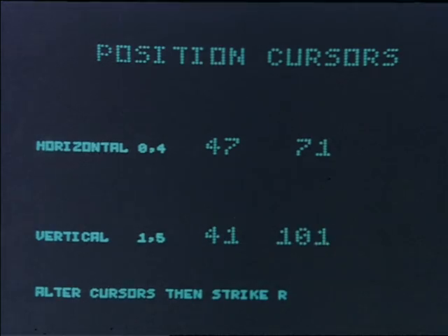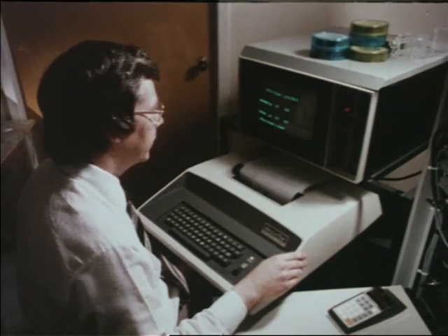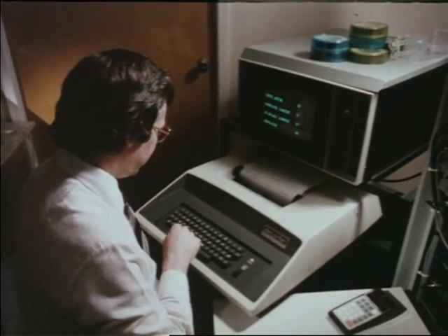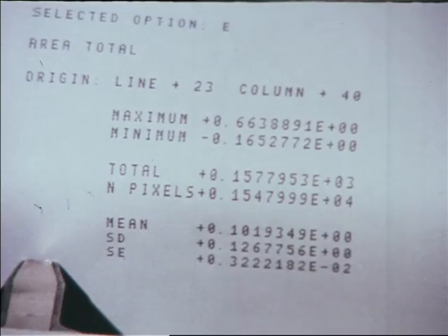The colors show how the density of the bone varies, and it's bone density that changes in many crippling diseases. The progress of such diseases can now be monitored. Any area of the image can be selected for investigation. Then the total weight of bone within the box is calculated. Effectively, they're weighing the bones. Precise measurements from an image which reveals a process within the human body. This vital aspect is common to many of the new imaging techniques.